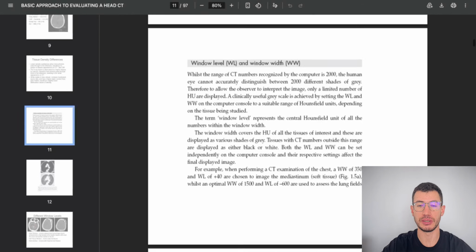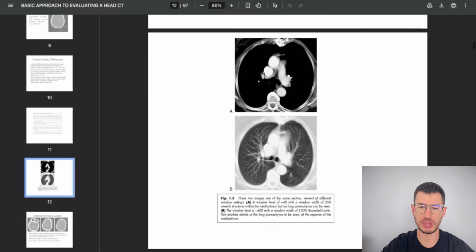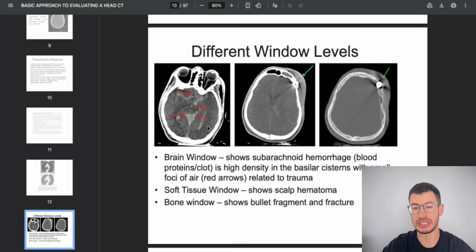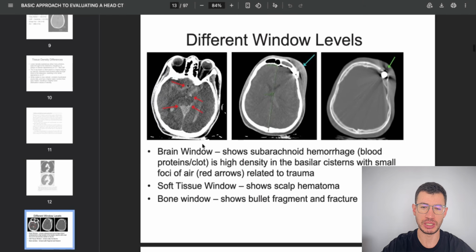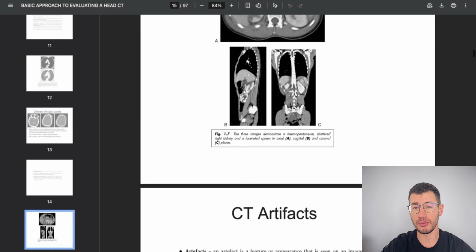Hi everyone. If you read medical blogs or clinical case breakdowns online, you usually just see static screenshots of a CT or MRI. The author has to draw red arrows to point out the pathology, place multiple scan pictures, because you cannot scroll through the slices.